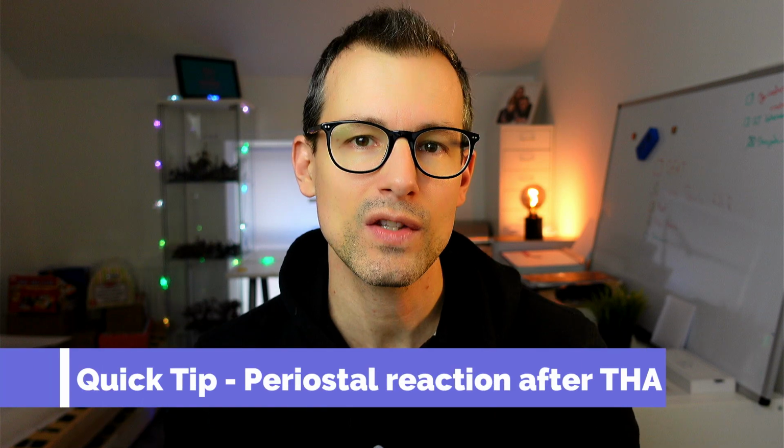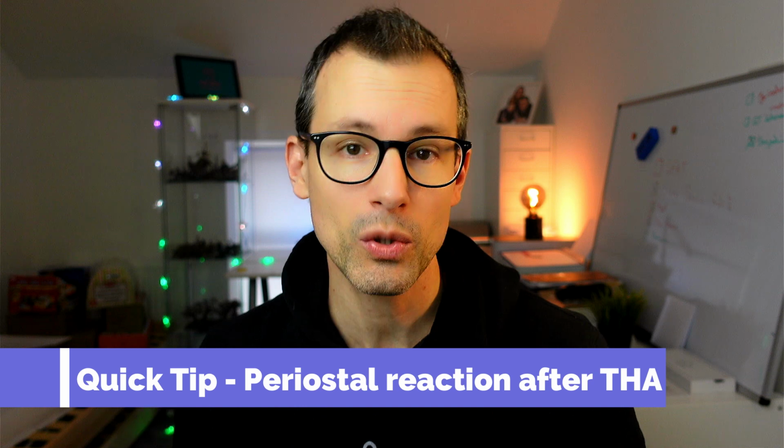In today's video, I show you a quick tip on how to identify a potential pain generator in patients after hip arthroplasty on MRI.